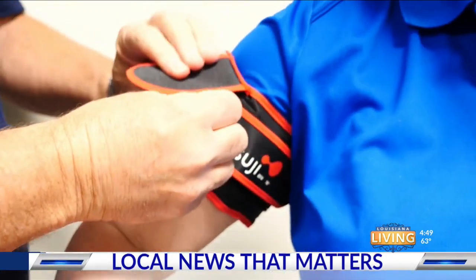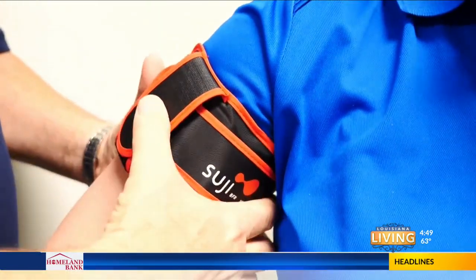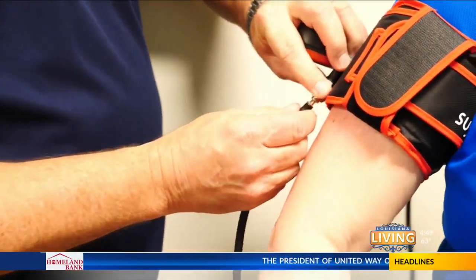This is not the newest trend in fashion. And it's not a torture device — it looks like it's a torture device. Just don't push that button.